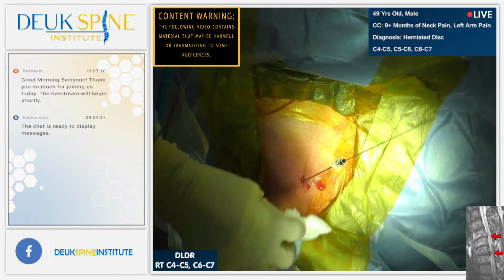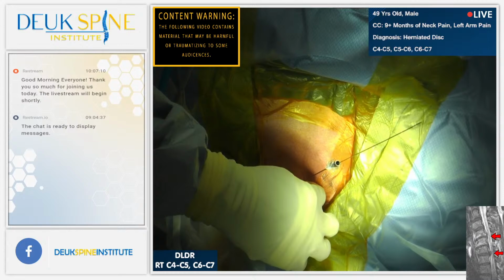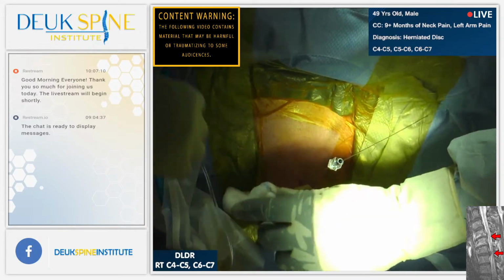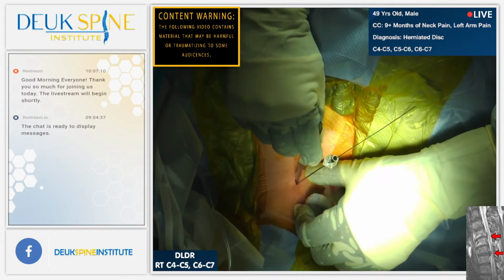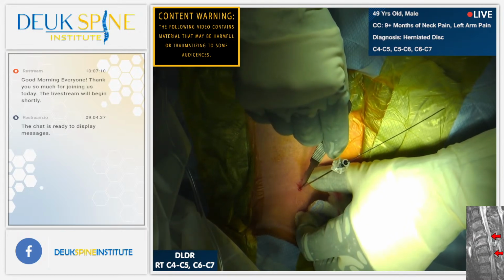The other needle. So, you want to wait? Yeah, we'll wait. You're right. So let's just do this first. Go ahead and run the video showing why herniated discs actually cause neck pain and arm symptoms. Meanwhile, I'm making a 4mm skin incision.